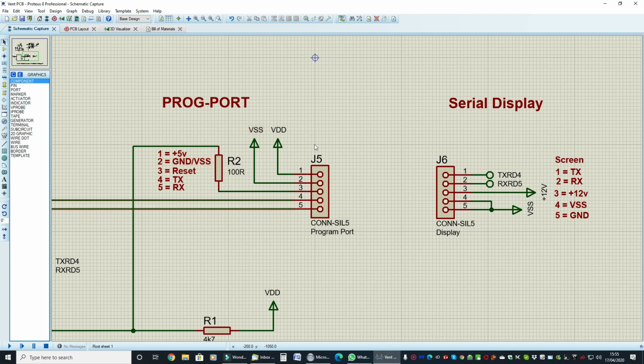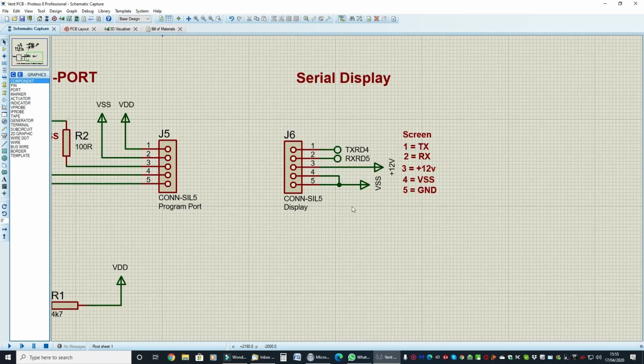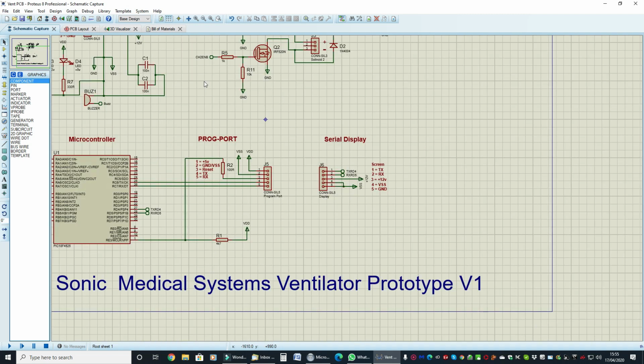So this is basically TTL level serial input. We've got a TTL level screen output here and input. So when we want to add the display, we'll simply do it from here.